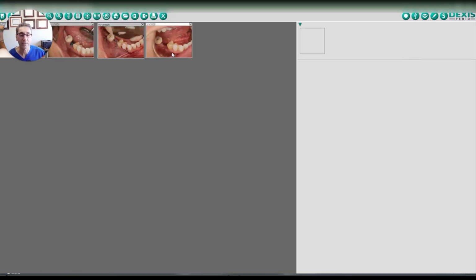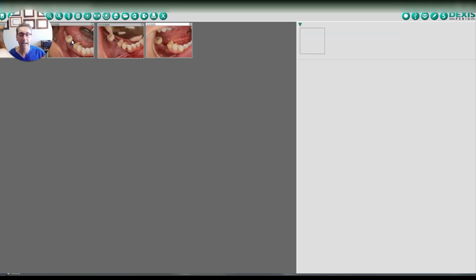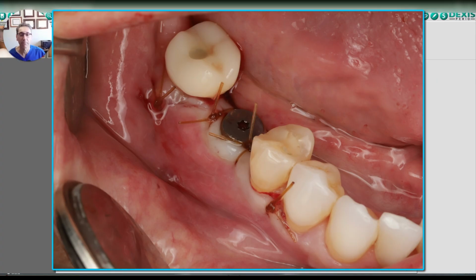And this is the follow-up photo. As you can see, everything is healing very nicely. On this x-ray and in the photo, you can see the titanium mesh. It's there, it's not exposed, it's safe. The next and final step is the second stage of the implant, uncovering. It's a very short procedure, about 5 to 10 minutes: numb the area, expose it, put a healing cap there, and we send the case back to the general dentist for implant restoration.